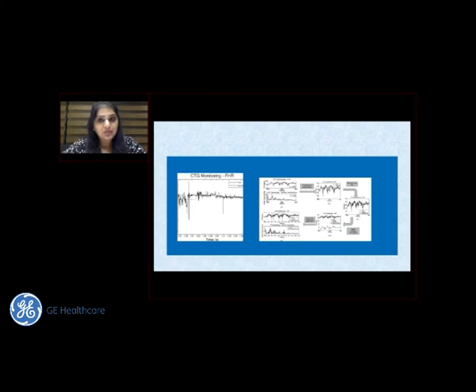In fact, by the time the CTG shows changes like decelerations or a non-reassuring CTG, the acidemia level in the fetus has reached a point which is going to do more harm to the fetus than if we would have intervened on an abnormal Doppler. So these are the reasons why you should rely more on Doppler rather than CTG for decision making.